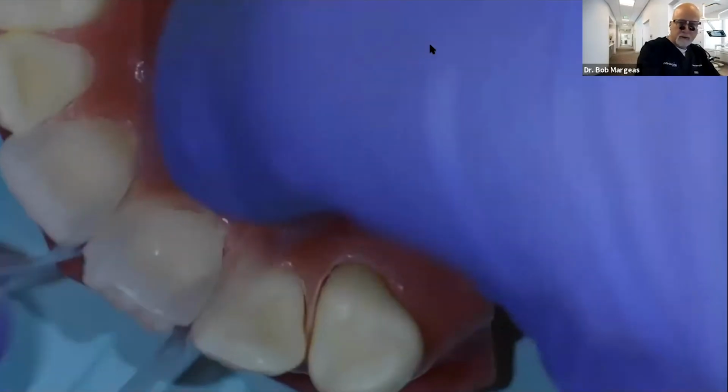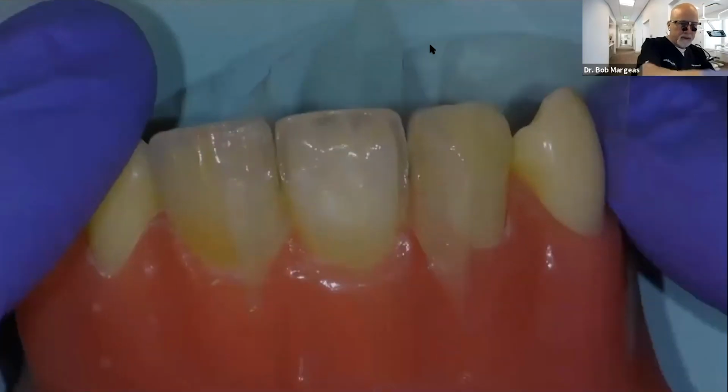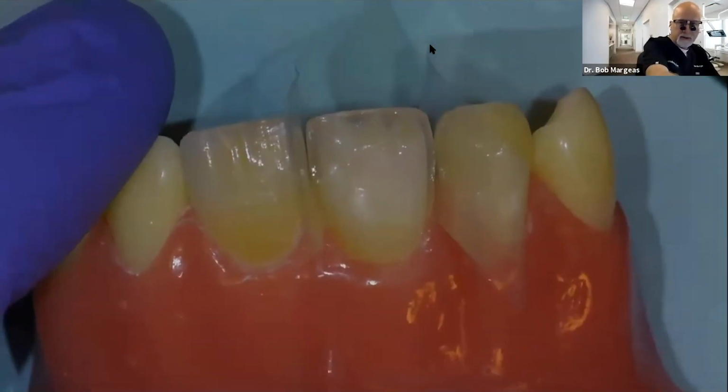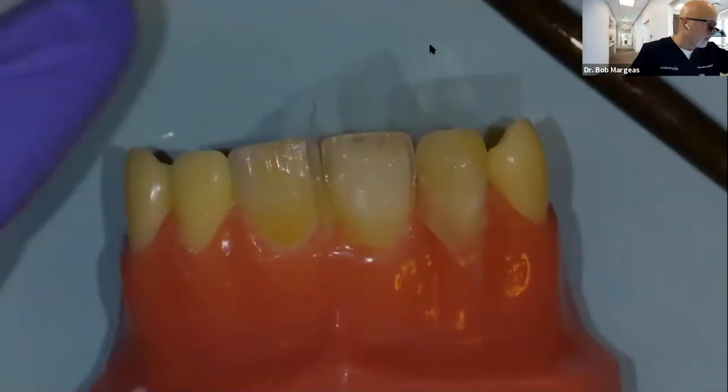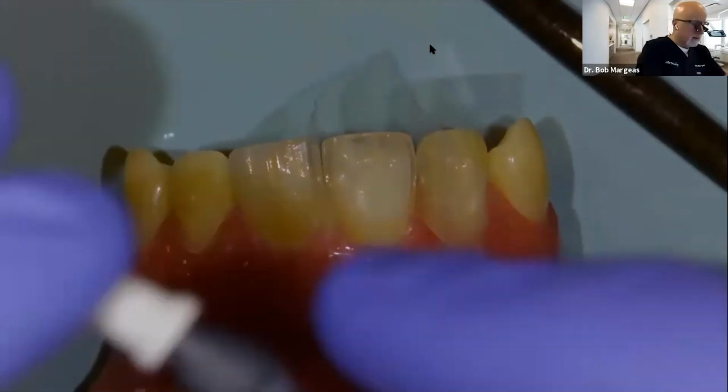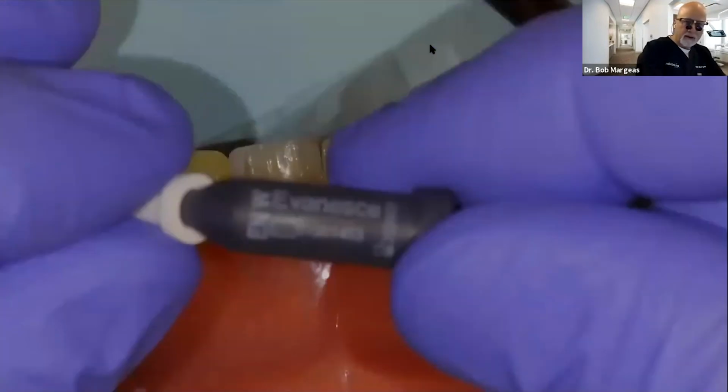So now, what I want to do here is use a composite shade that is called enamel white. This is an achromatic shade.